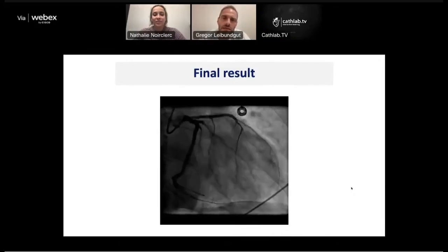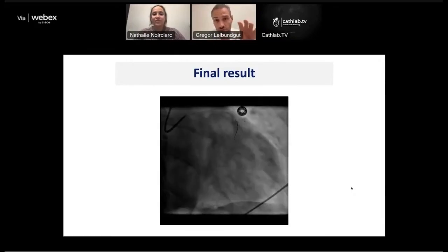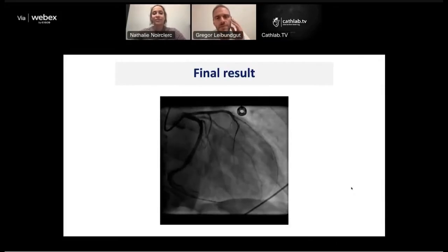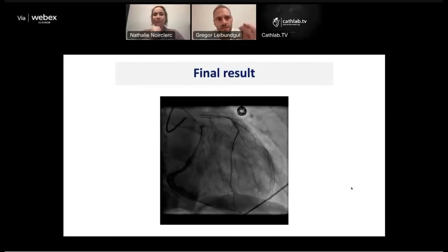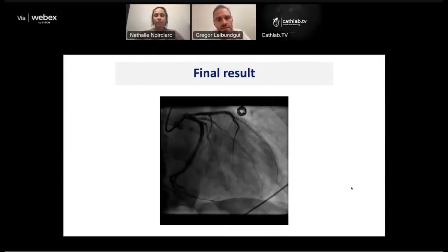And also Alex, Achim and myself have published a case where we did shockwave to a polymer drug-eluting stent, and we did some electron microscopy analysis, and we saw that the polymer actually gets disrupted. So it also destroys a little bit the stent.